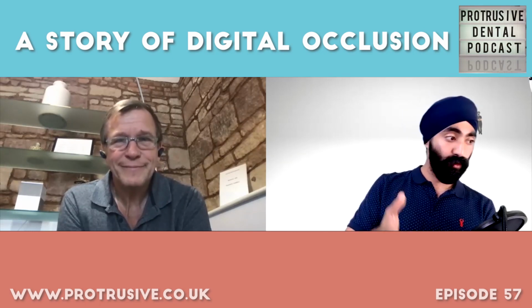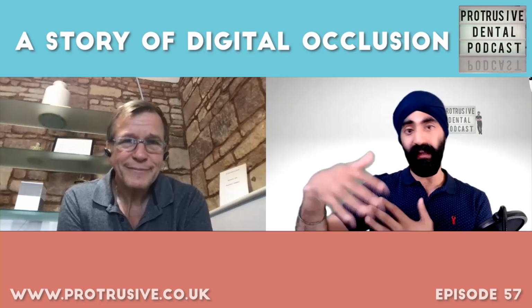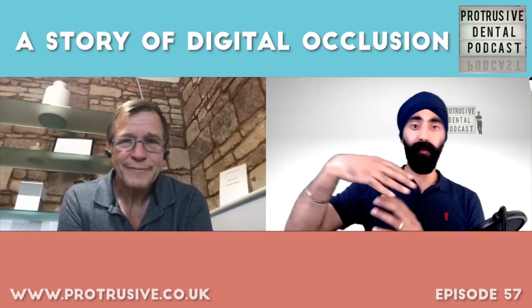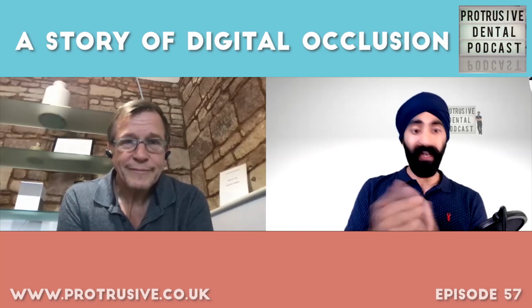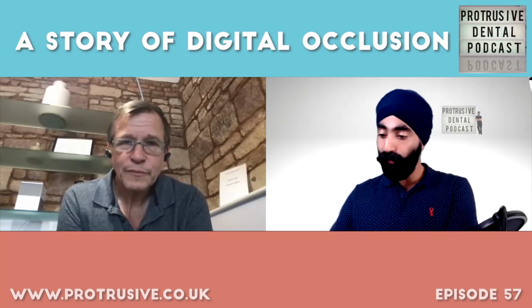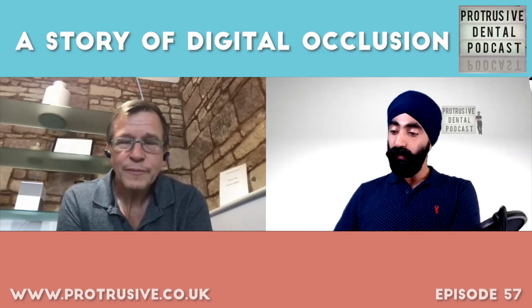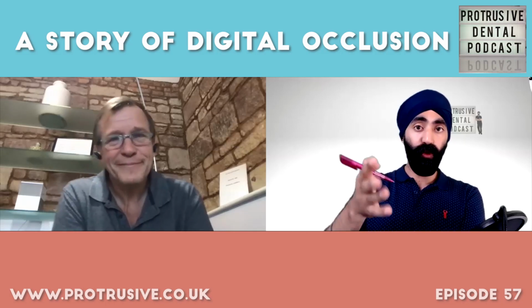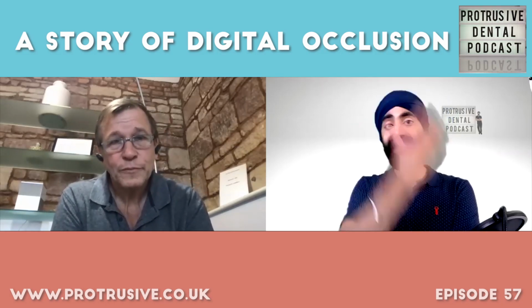And it's exactly the reason what Ian just said. When you record it at the vertical, you remove that element of potential error of actually opening the vertical. So that's what Ian's been talking about. And now going forward from that, the questions we've had is, we've essentially answered it, Ian. The virtual facebow is essentially what you're using, a face scan incorporated.